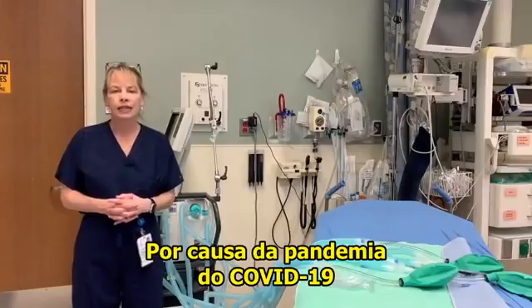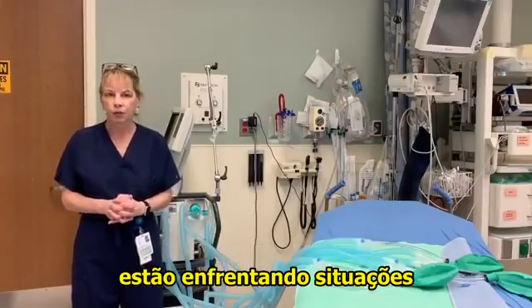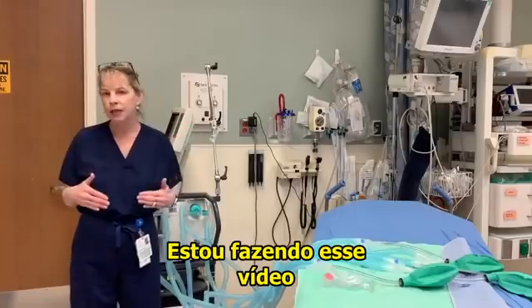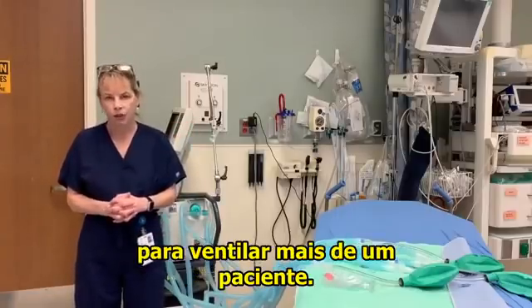Because of the COVID-19 pandemic, many health care providers are struggling with a situation where they may have more than one patient needing ventilation and not enough ventilators to go around. That's why I'm putting this video together — to show you how to modify one ventilator to ventilate more than one patient.